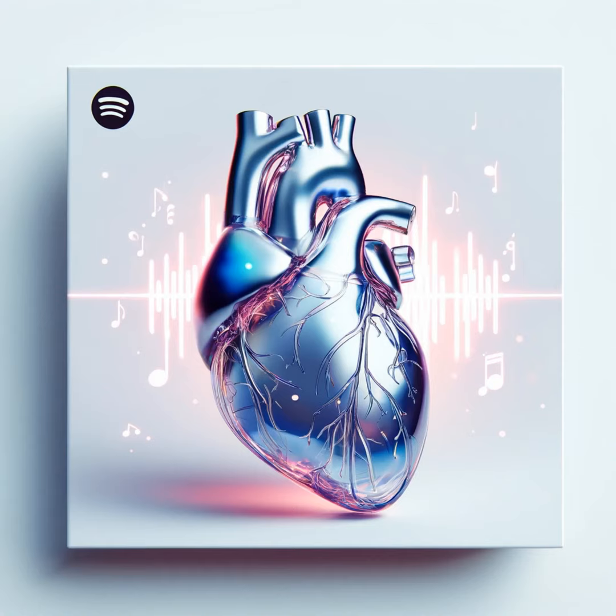Aortic regurgitation is an issue after LVAD placement. 25 to 50% of post-LVAD patients will develop moderate or higher AR within 1 year of LVAD implantation. In an LVAD patient who has developed moderate or severe AR, Doppler flow across the inflow cannula and outflow graft will be normal or increased due to the aorta to LV to LVAD blind loop.